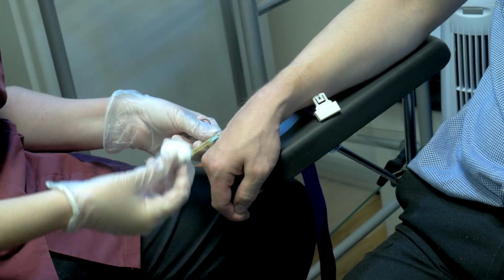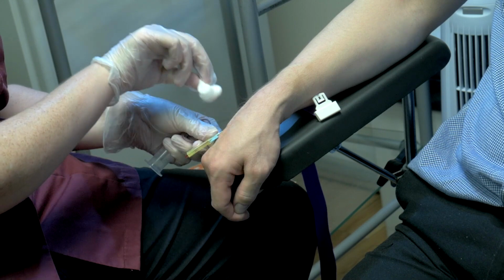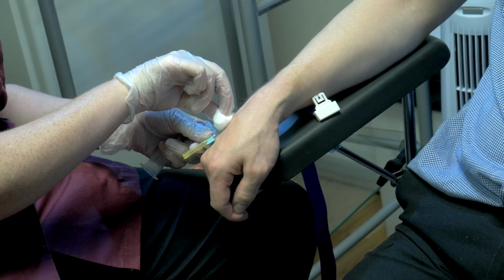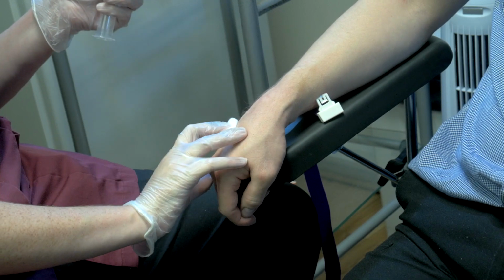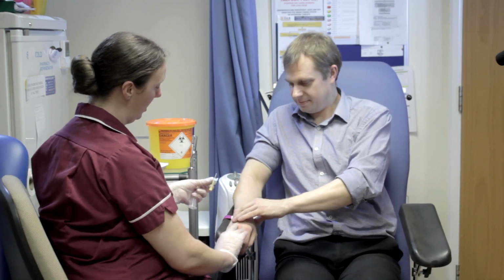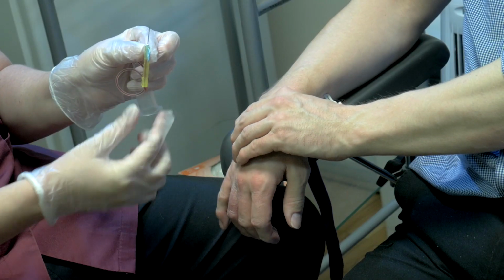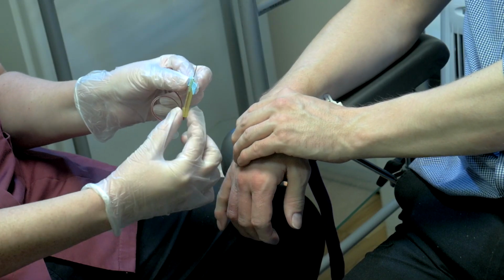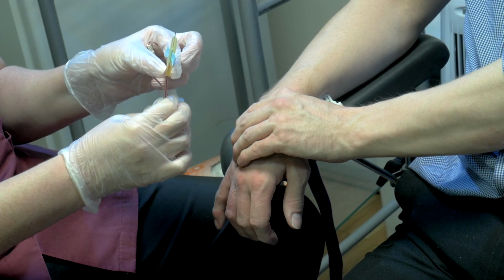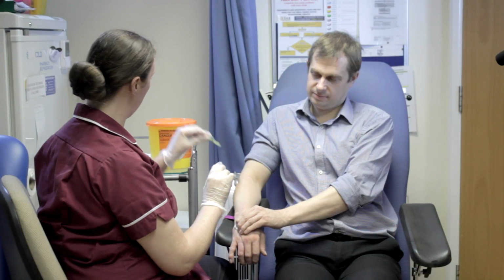I'm going to get my cotton wool and hold it just above the site. So I'm not actually touching the needle, but I'm holding it just above the site. I'm going to pull my needle out smoothly and pop some pressure on there. Now if you can just press on that as hard as possible, I'm going to engage the safety mechanism. So we hold the very bottom of this yellow bit just here, and then we pull down on the tube until it clicks before we get rid of it in the sharps bin.